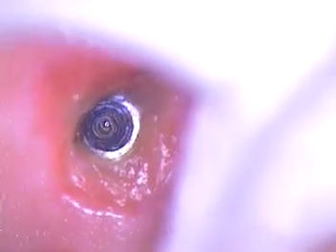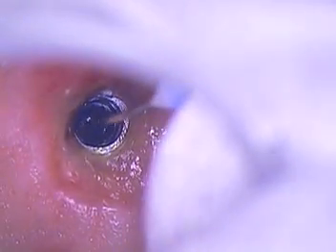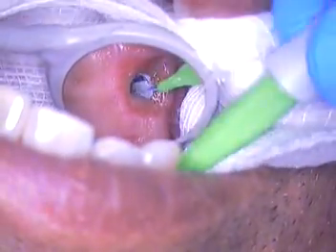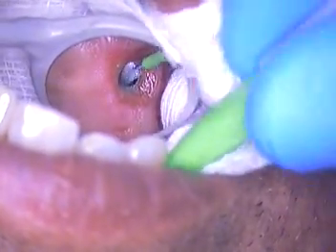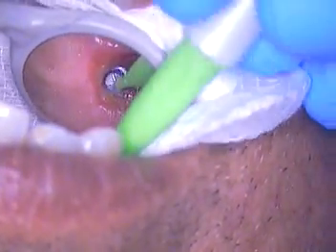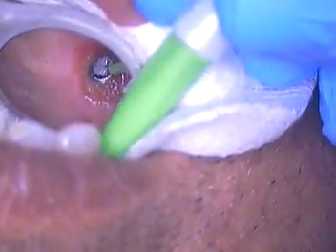The rest now is real simple. As the solution becomes less cloudy and becomes perfectly clear, and we don't see any bio-burden or any old blood — sometimes blood gets caught in there — we're going to use a little proxy brush, and go right inside, just turning it back and forth, clockwise and counterclockwise rotation. Bring that out and look at all the stuff that's in there. I feel like I'm going all the way down — it feels like it's engaging well into the thread, so that's good.